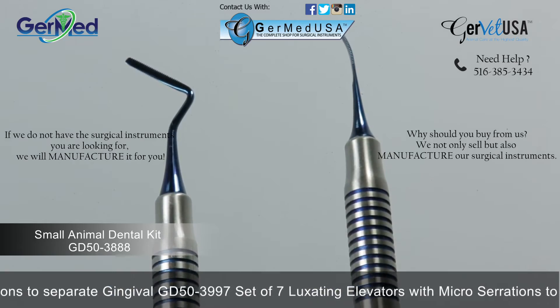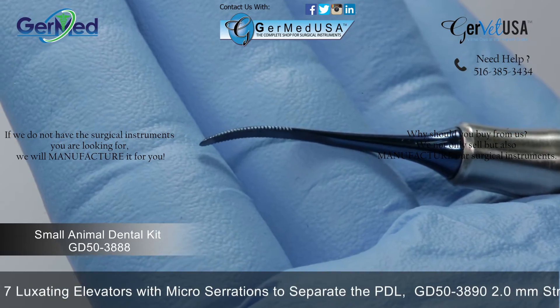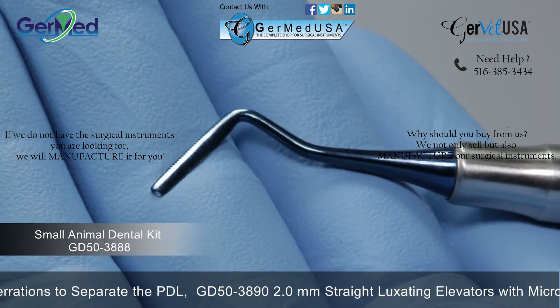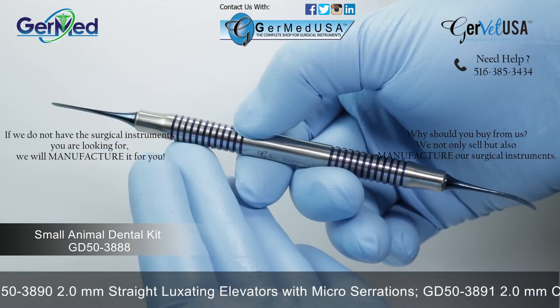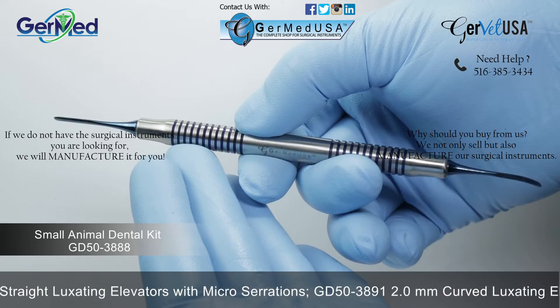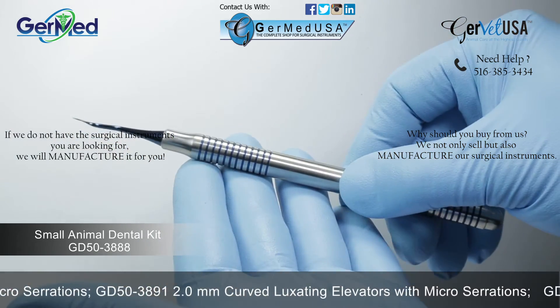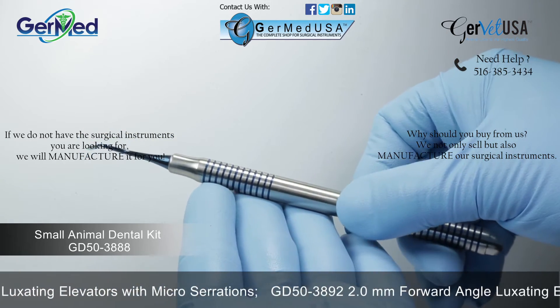Periotomes are used in dental extraction procedures to cut gingival before any separation may be done between the tooth and the PDL. The small animal atraumatic extraction kit features the periotomes with a 0.5 millimeter blade with straight and curved angles, and a thin blade measuring 0.5 millimeters with micro serrations to separate gingival.